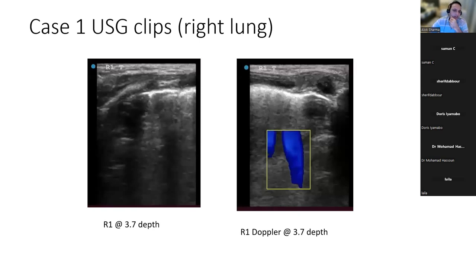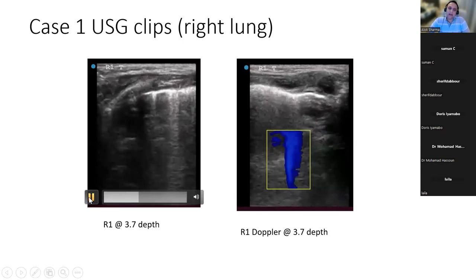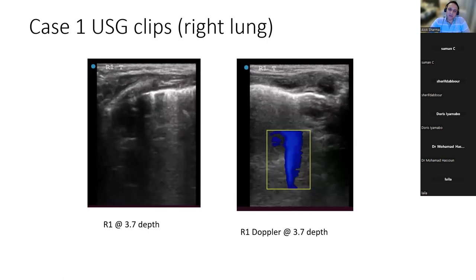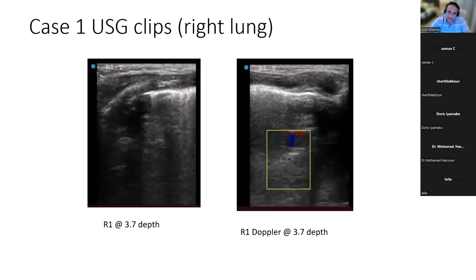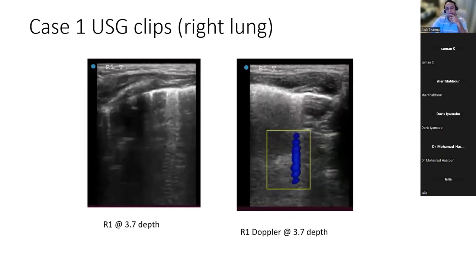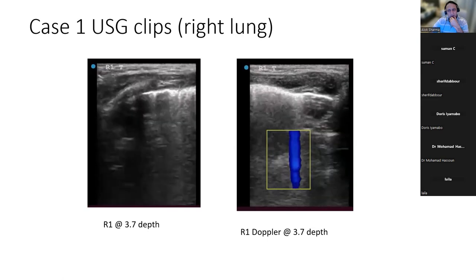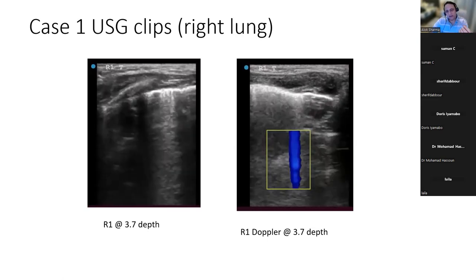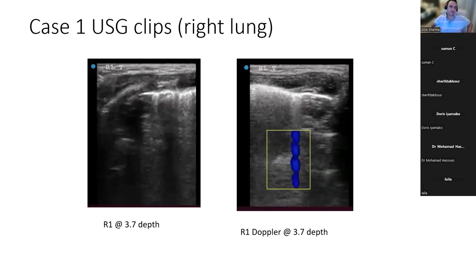So just again, I'd say that you can probably get slightly sharper, crisper images here. The way to do that, from my perspective, is you have to play with a little bit of your gain setting. And I mean, you're using a Siemens, you said, right? No, Sonosite. Sonosite has got a sharp mode. There is a sharp mode there.